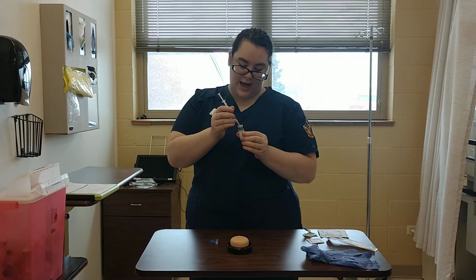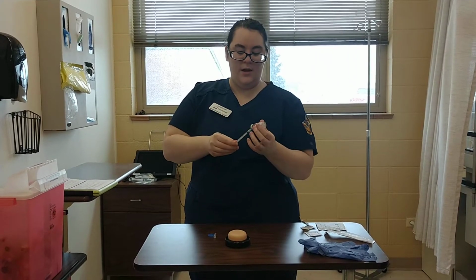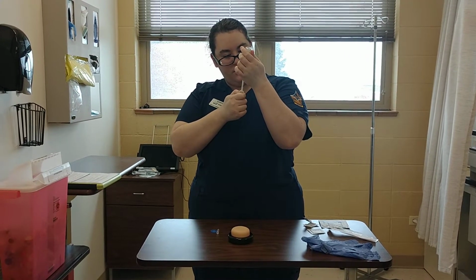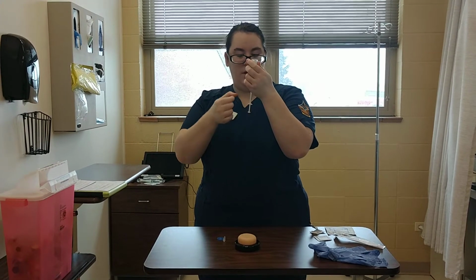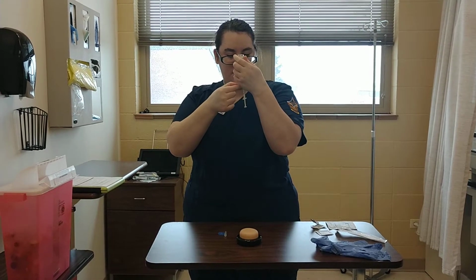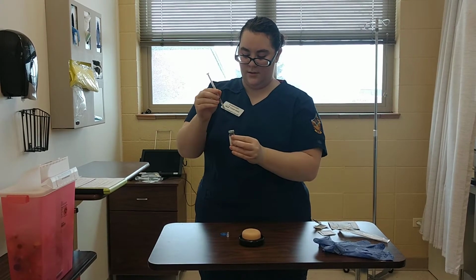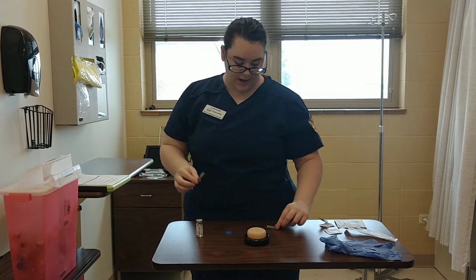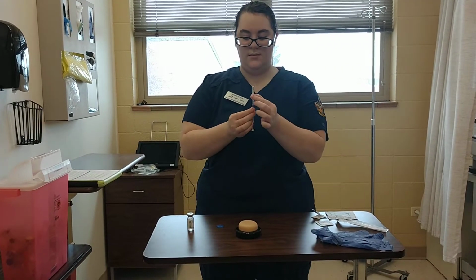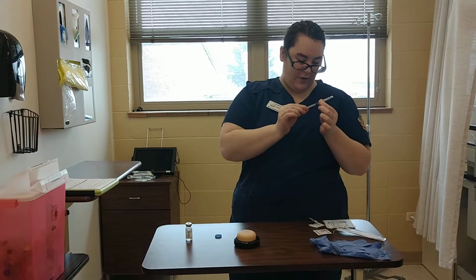I'm going to put the syringe in at a slight angle to prevent coring. Okay. I'm going to put that upright, and I'm going to withdraw my medication. I'm going to tap the needle to get rid of any air bubbles. There we go. Okay. I'm going to recap the needle using the one-handed method. And I'm going to check the medication again to make sure that I have the right dose.